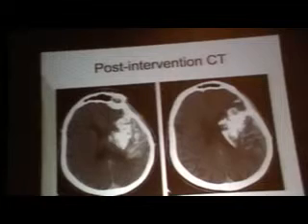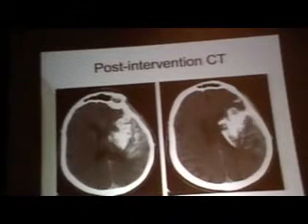And this is the result. The patient had a reperfusion hemorrhage despite a nice technical result. So we do make errors in judgment.